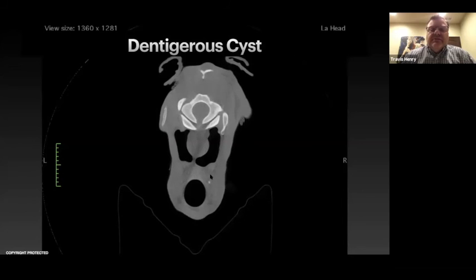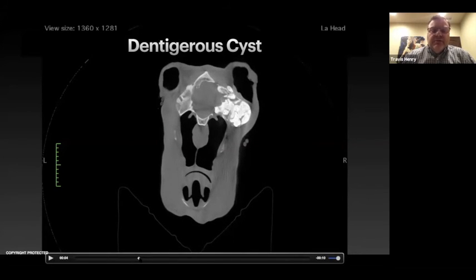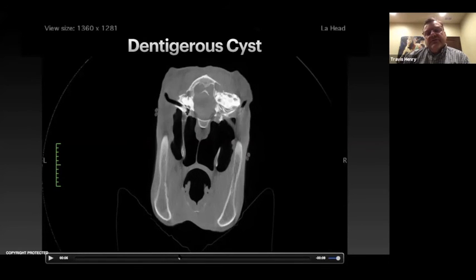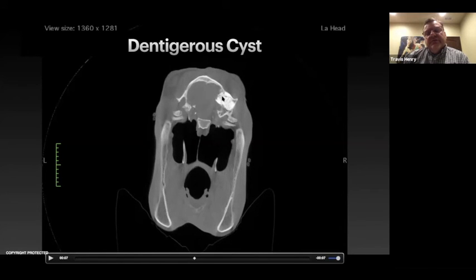It's another one that was in just recently. And if we stop this, we knew we had a big dental mass here, but it's actually a culmination of several teeth in this horse. You can see that it's already close to the brainstem here. We move forward into the actual brain. We can see that there's tooth material in the calvarium and in the brain.